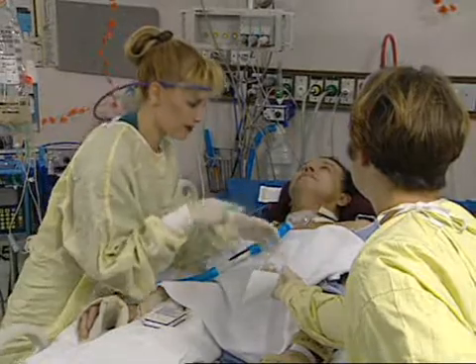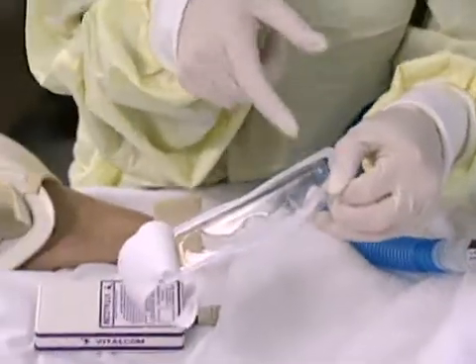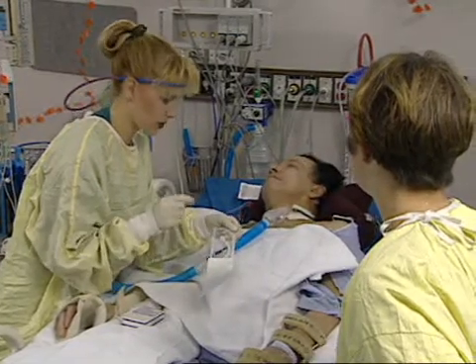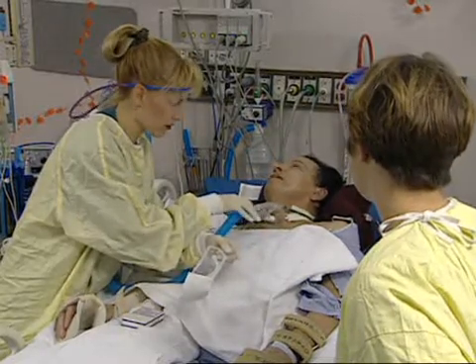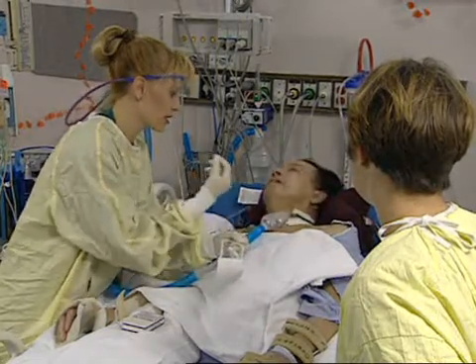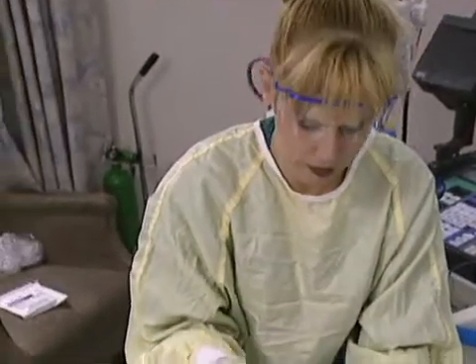And you see that it's curved and it's sterile. Now this is going to go inside of his trach, and I don't want to contaminate the part that's going to go inside. The tip here has a little tab ring that you can hold on to, and that's the part that I want to hold on to. And you can see that it's curved to fit the curve of the trachea. And when you insert it, you're going to have to follow that curve. So it's not like you want to force it. And you want to be careful not to push too hard into his trachea, because it'll make him gag and cough, and it'll be like me pushing on your throat.